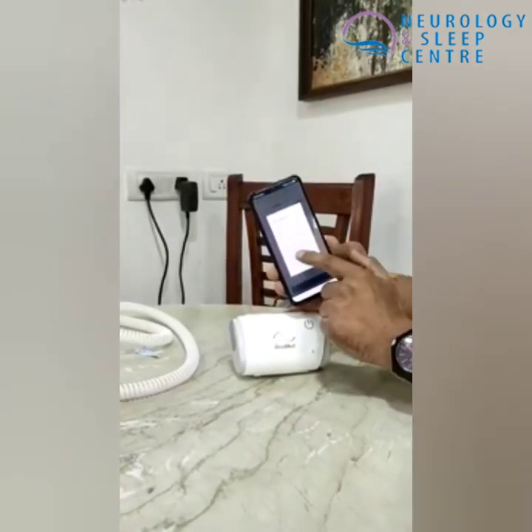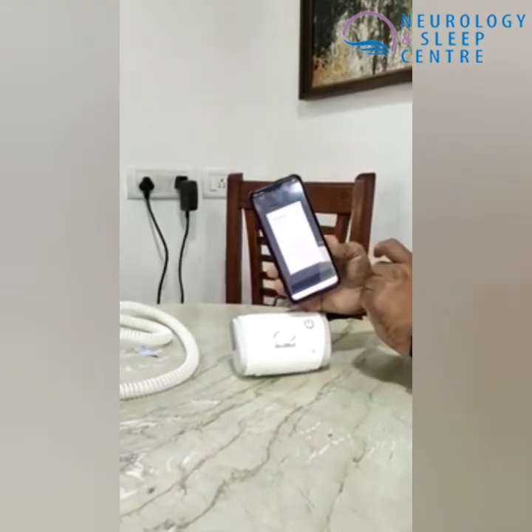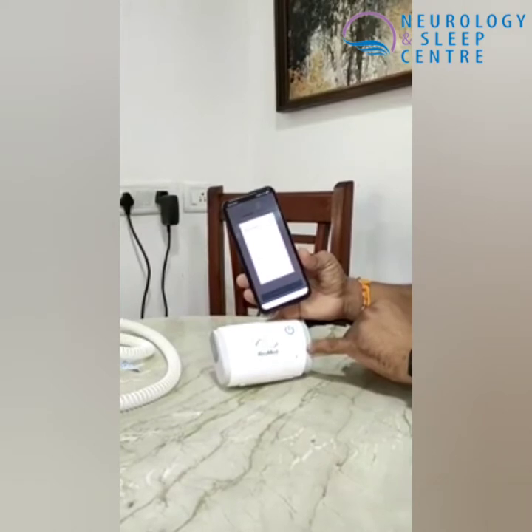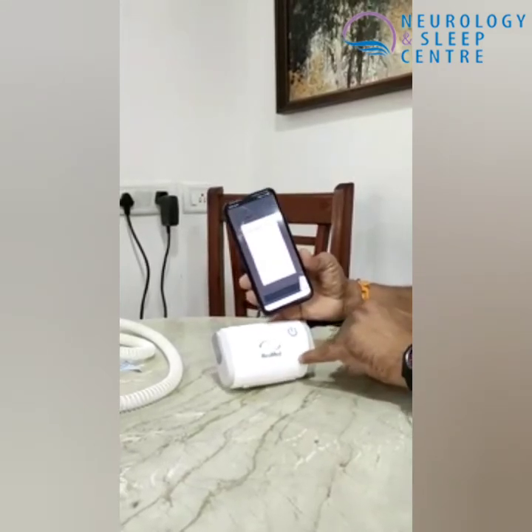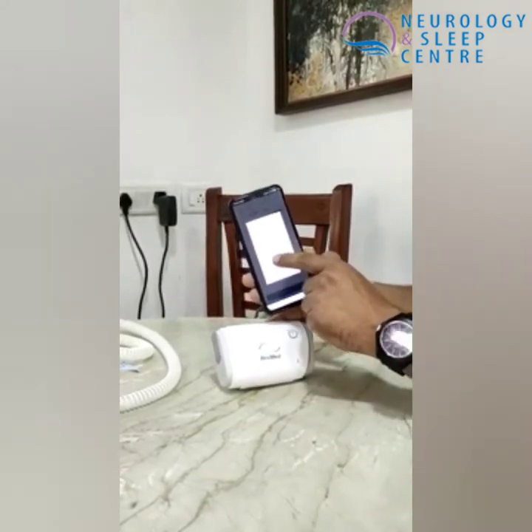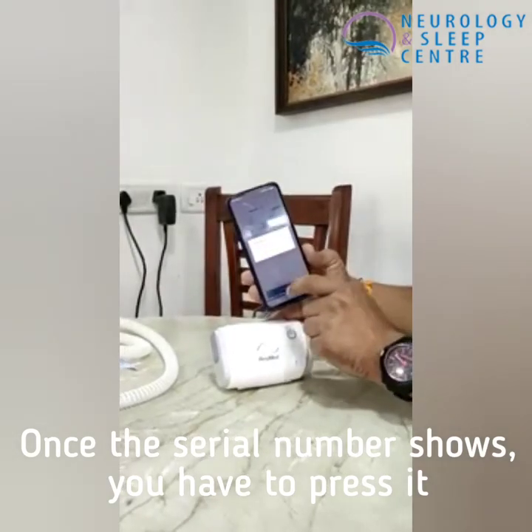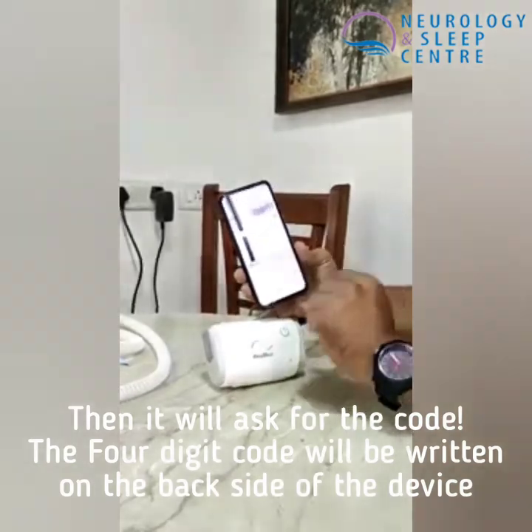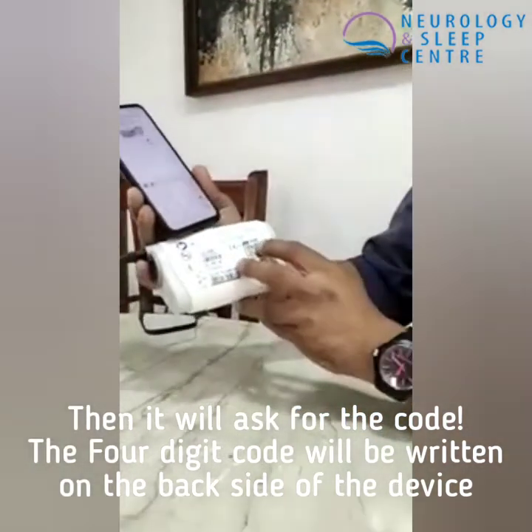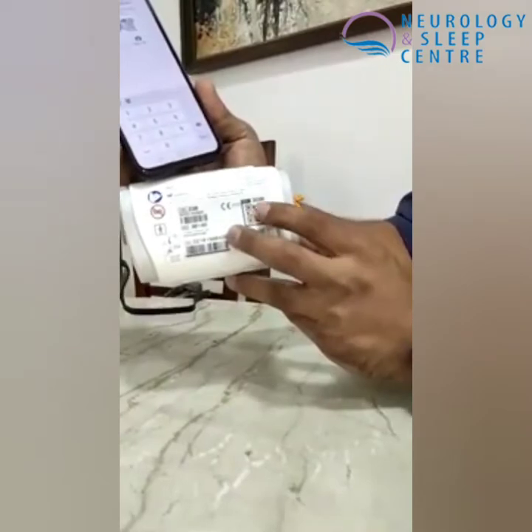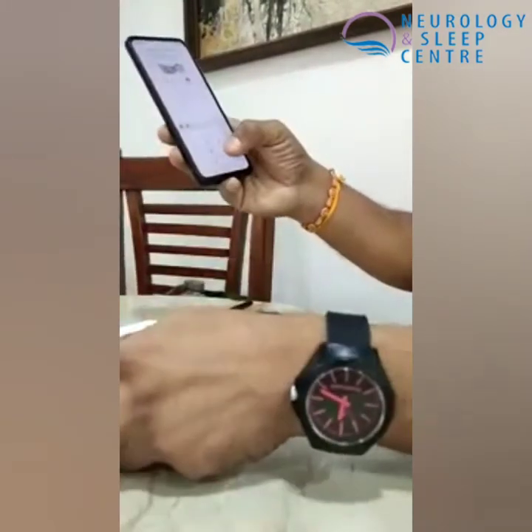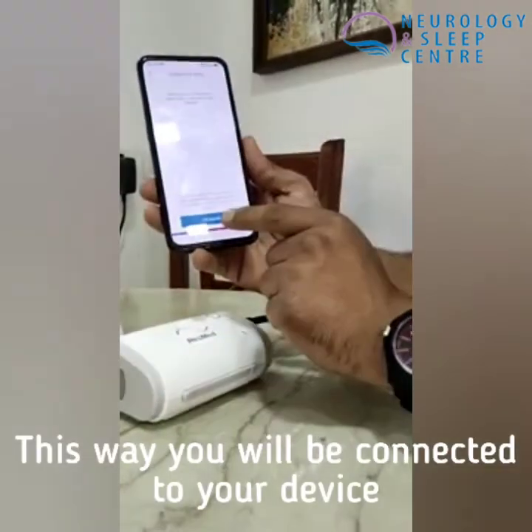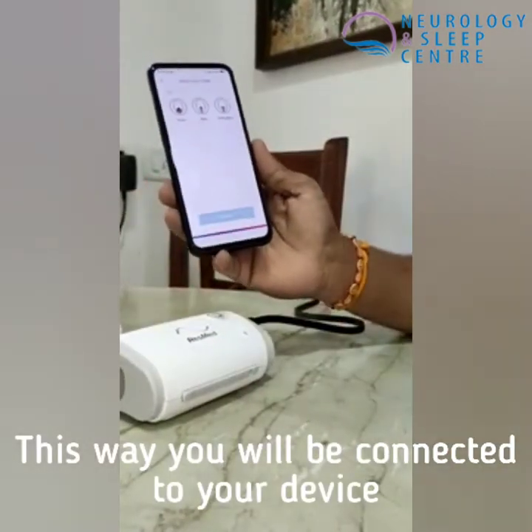The app is searching and going to pair with the device — it will pair in about 30 seconds. Now the serial number comes up on screen. I press the serial number and it asks for a code. There are four digits on the back of the device — the code is 3038. I've entered it and the connection is now connected. Get started.